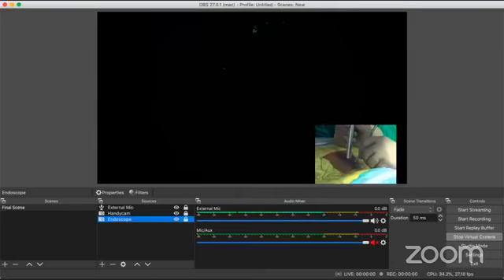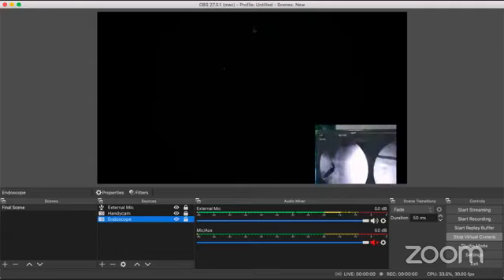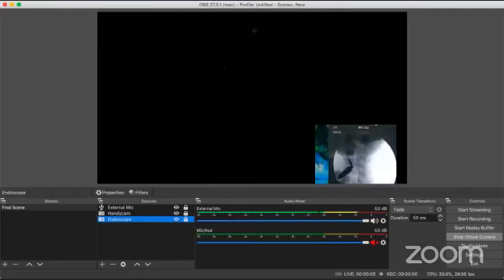My dear friends, I'm going to show you the C-arm image of what I've done. I'm going to take a live shoot, though it's not good for me and my health. I showed you the movement of my dilators. Can you see both my dilators are now focused exactly where I want them to be?